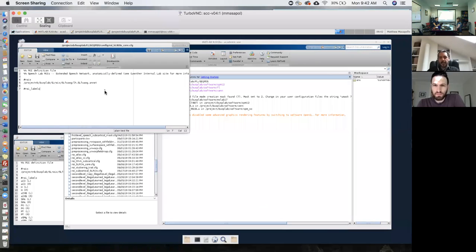It sounds like Jason has a transformation that puts those surface spaces into MNI space. You can't rerun it in surface space, or it won't match up if you rerun it in surface space. If it's imperative that it's in volume space, Jason has an ROI that will work with that. But it sounds like it's better to use the surface space, because that's what these ROIs were intended for.